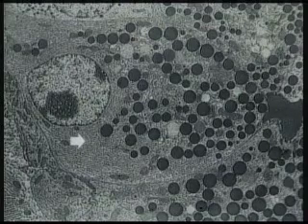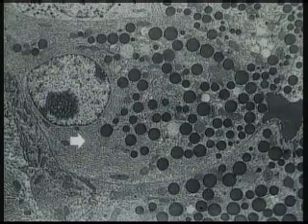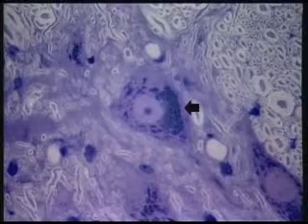The rough endoplasmic reticulum is encrusted with ribosomes, and the nucleic acids attract the basic dye, which is hematoxylin, which is purple. The secretory granules are here and here and here. These are very acidophilic. These would attract eosin, and hence they'd stain pinkish or red in H&E preparations. And you can see where they're pouring into the lumen right here.